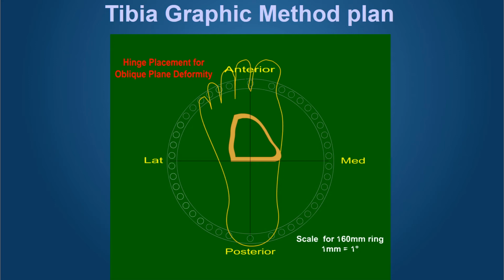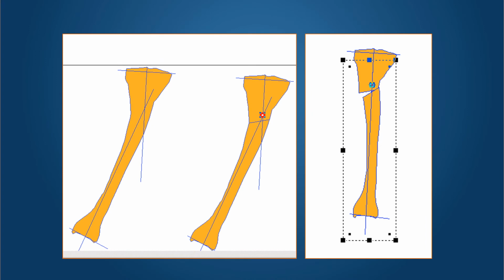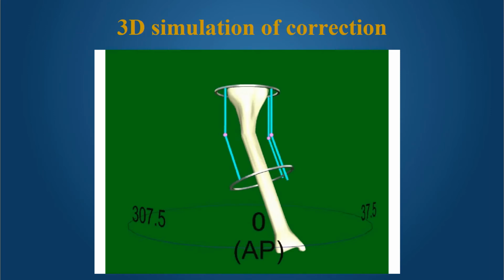If we wanted to perform a closing wedge correction, we would use the purple line to outline the hinges. If we wanted to perform a neutral wedge correction or a rule 2, it would be in the center, and the blue line represents the opening wedge correction if you wanted to open a wedge and create a triangular wedge of bone. But in this lady, we want to use the white line, which denotes the neutral wedge, and hence decided where to perform the osteotomy in order to get a good lateral translation of the distal fragment and invagination of the fragments to give stability and healing.